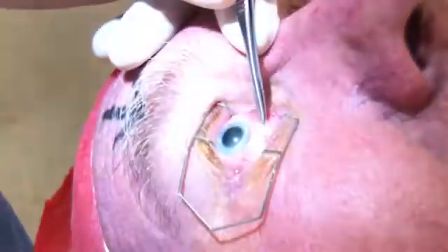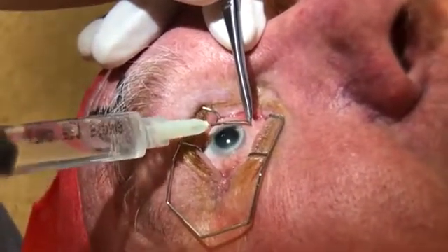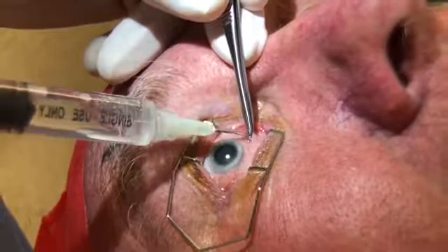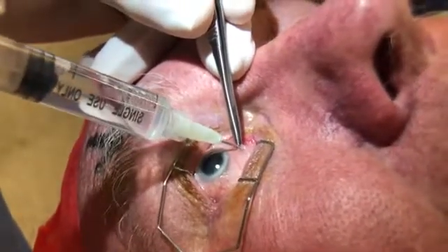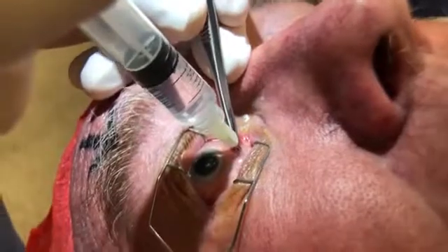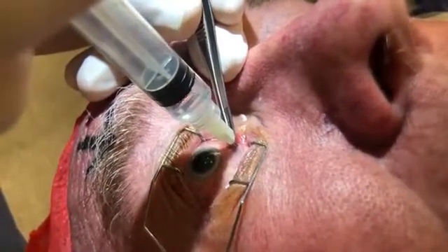Now through that little nick, I'm going to squirt the local anesthetic. There we go. Now I'm just going to squirt a little bit — I'll just move my hand. That's all going round your eye now, all that local anesthetic, good.